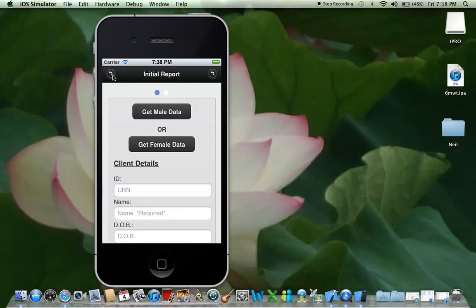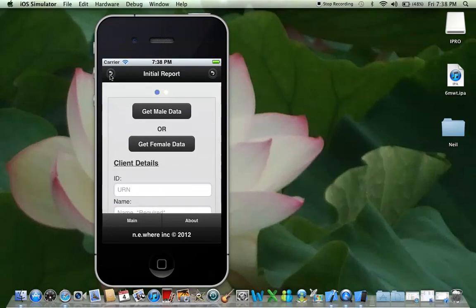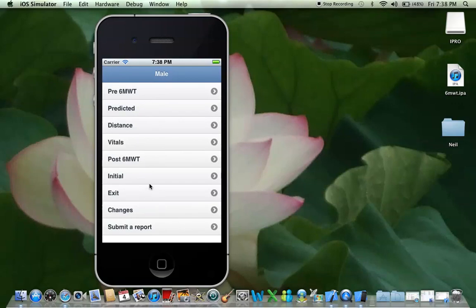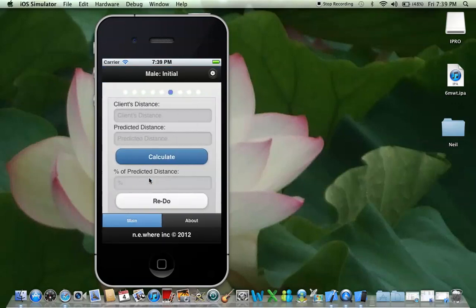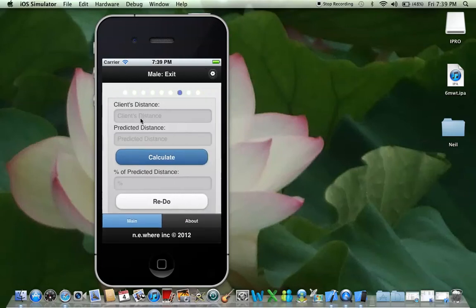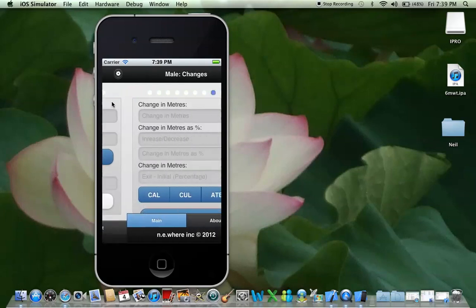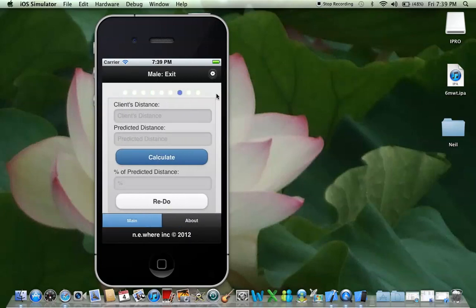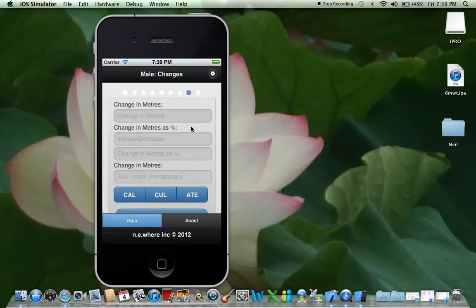Now going back to the exit assessment. If it's the exit assessment, you would also fill in the initial assessment — you'd have all the data in the chart. The changes section calculates changes between the initial assessment and the exit assessment, so those figures are very dependent on both being filled out. You don't need it when doing an initial assessment because you haven't done an exit assessment yet.